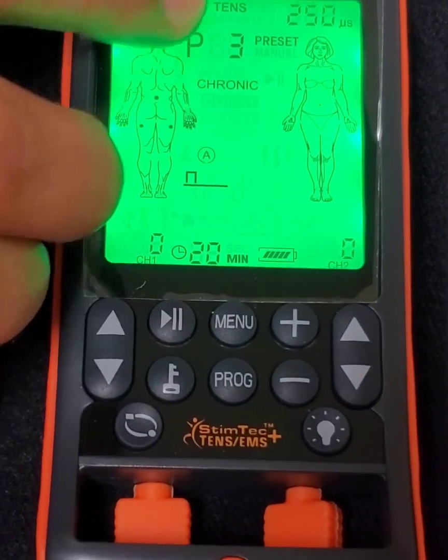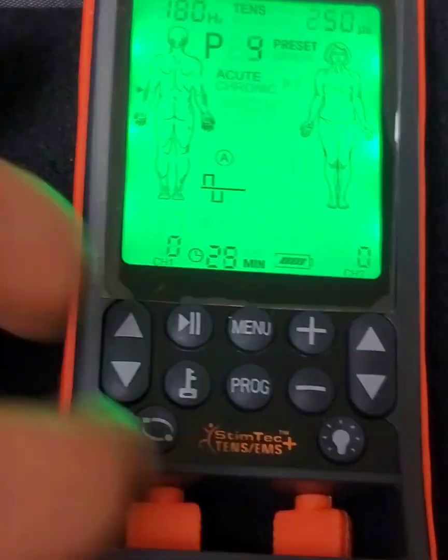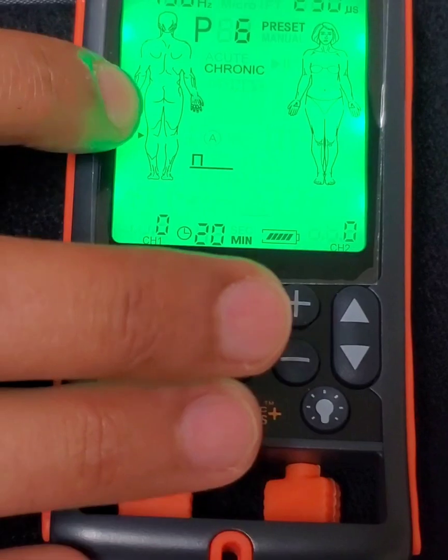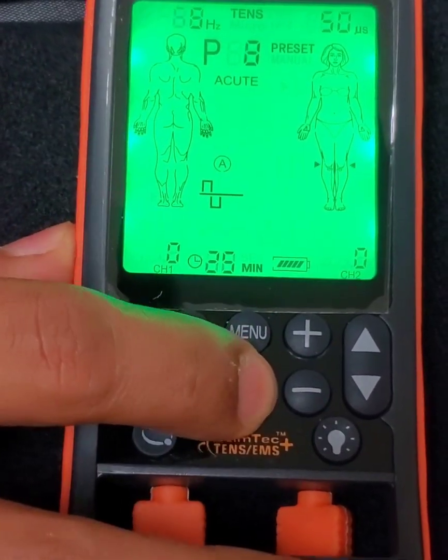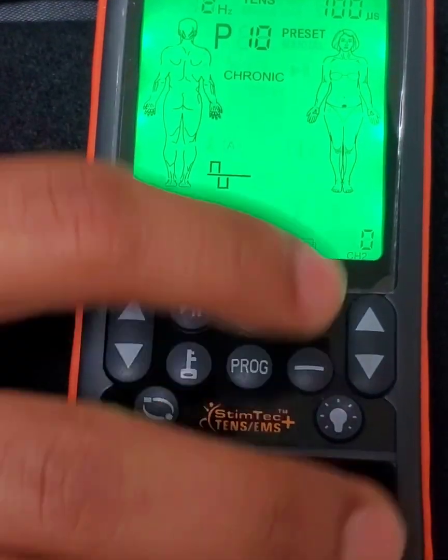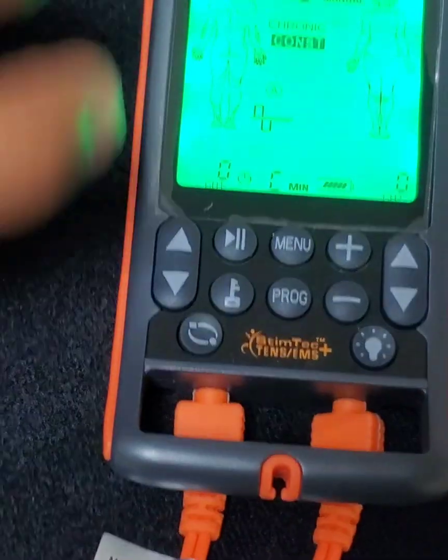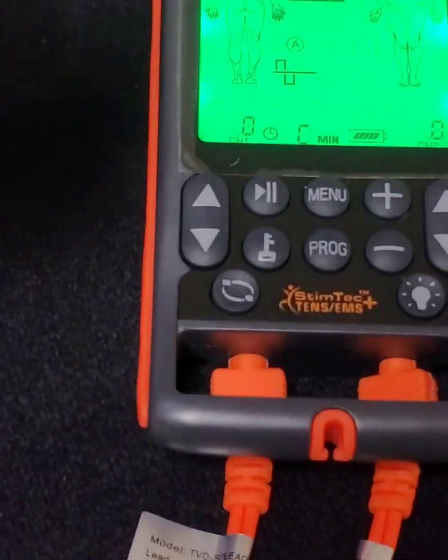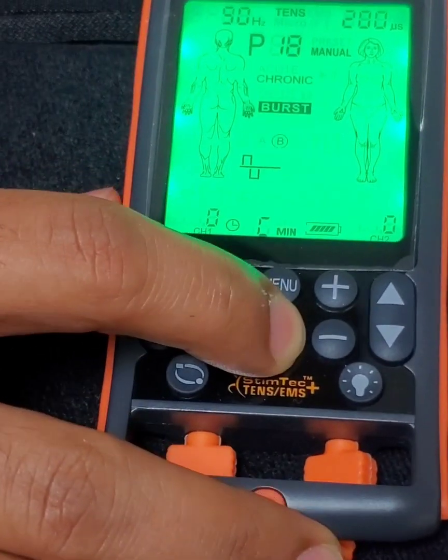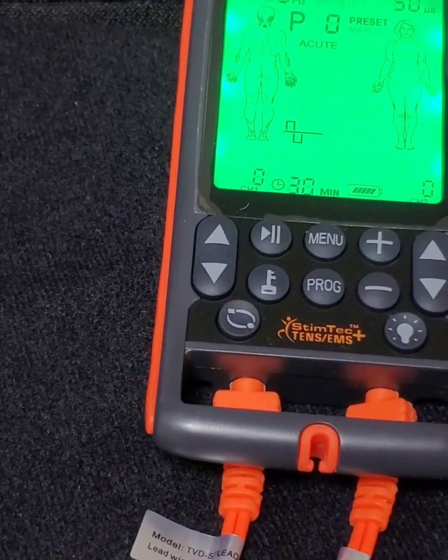Hitting the program button again goes to sciatic pain (preset 3) for people with pain going down their legs. Hit it again and it goes into elbow pain, wrist pain, knee pain, ankle pain, and then knee pain but acute, hip pain, menstrual pain, and headaches. After that, the remaining presets are based on how the impulses are delivered rather than specific body parts, going up to 19. After 19, it cycles back to 0, which goes back to the neck.